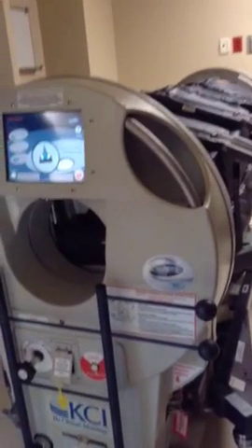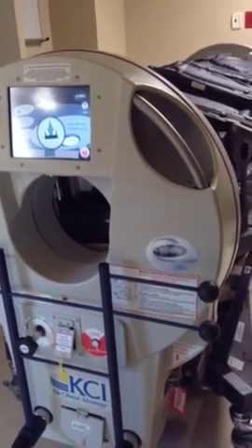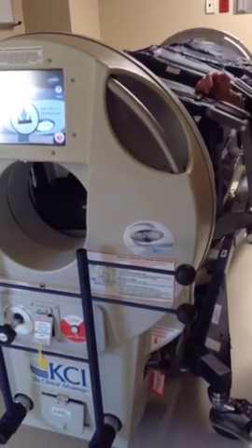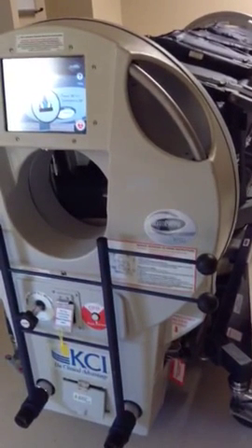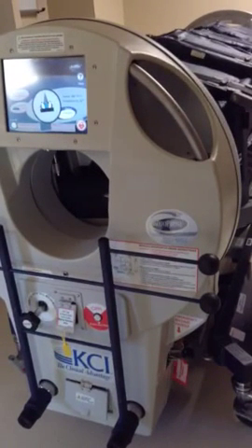Okay, perfect. All right, so now it no longer has control of us at all, because the way we would mitigate that is that we would swap the units out. And I kept telling corporate, the patients are too sick. Our mitigation is not a viable option. You need to come and see what happens. So we set up a sim lab. We invited all those people into a usability study, and the legal and regulatory people totally freaked out because our dummy was dying in the sim lab.